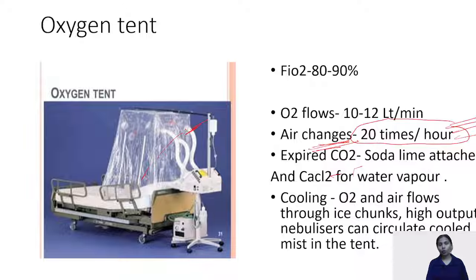Then of course we have soda lime, which is attached for the expired CO2, and for water vapors which are present, we have calcium chloride. I repeat, for water vapors we have calcium chloride. For CO2, expired CO2, we have soda lime.